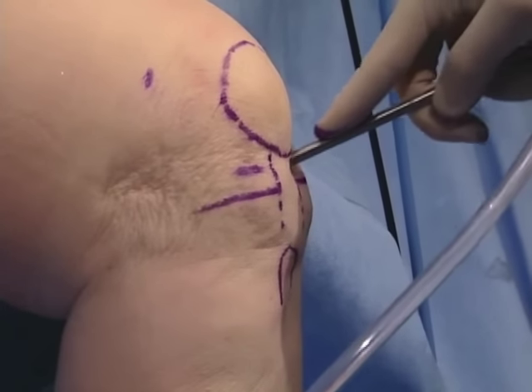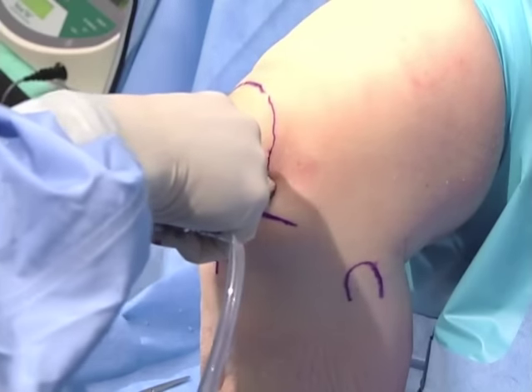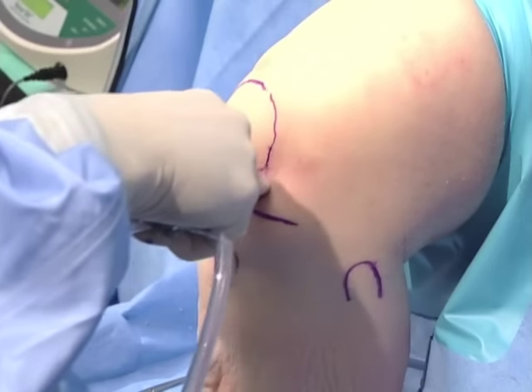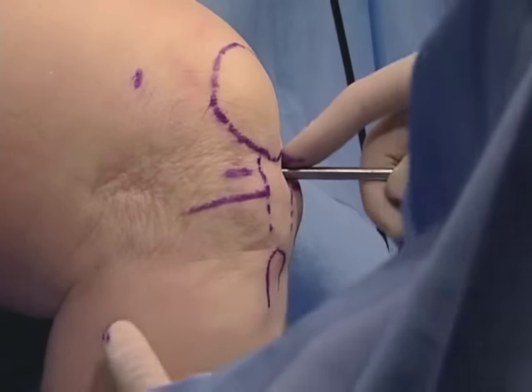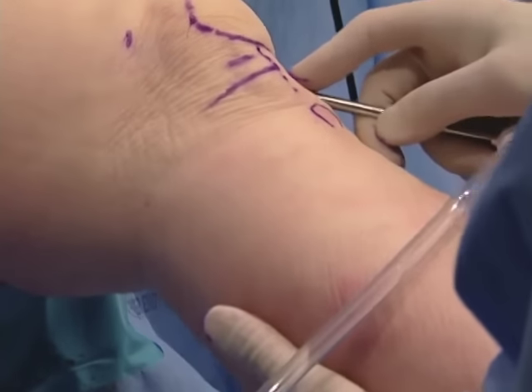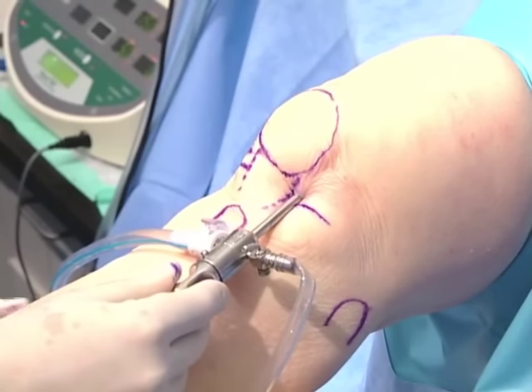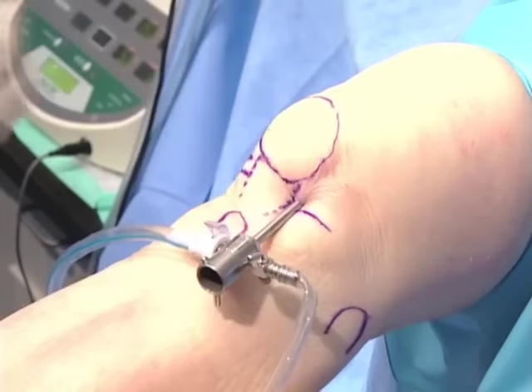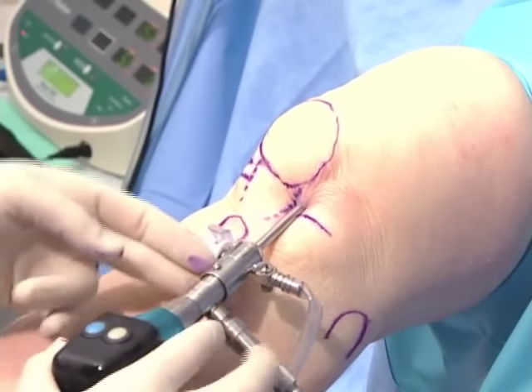Angle to parallel the tibial plateau between the condyles and push into the intercondylar notch. You may want to go in and out a few times to make sure it's loose, then pull back just enough that you're outside of the condyles. Straighten the knee and slip under the patella. After slipping under the patella with the knee in full extension, remove the obturator and put the arthroscopic camera in the cannula.